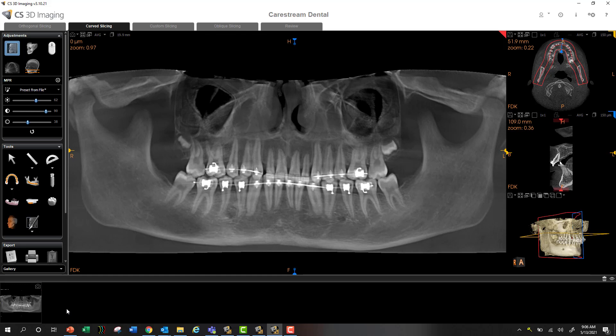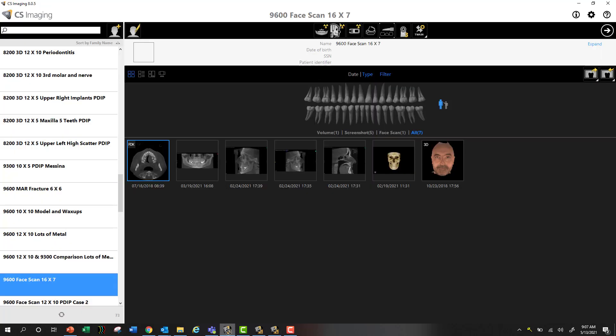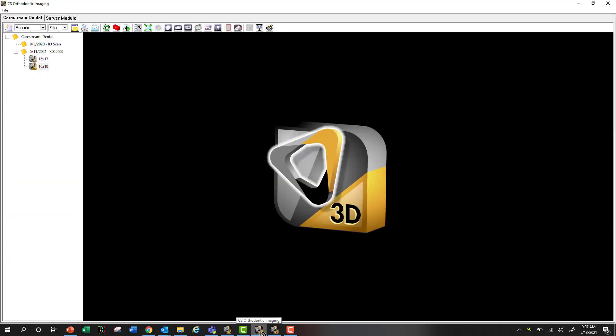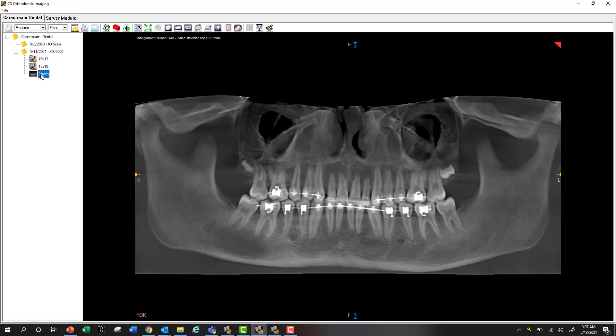All I'm doing is left clicking on it and holding it and dragging it over my imaging software, keeping my left mouse button held and dropping it on my visit date. Let go. And that image is now right in my record.